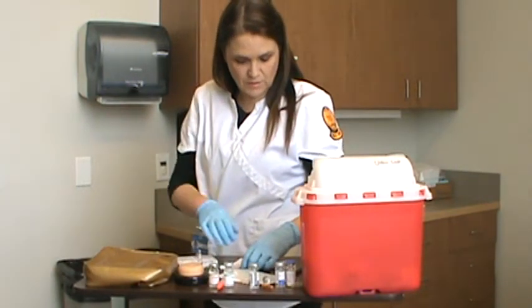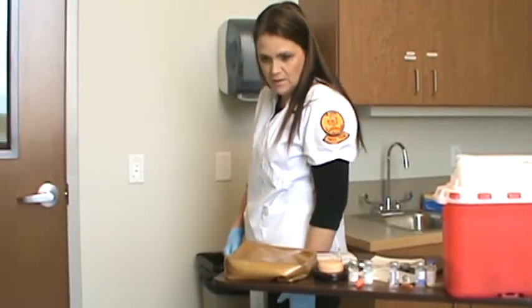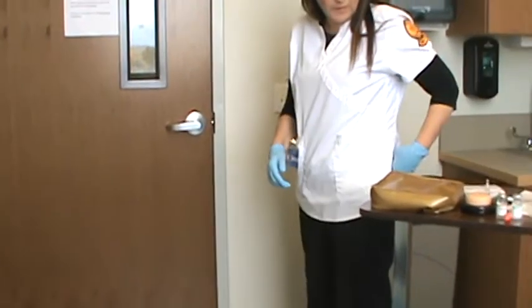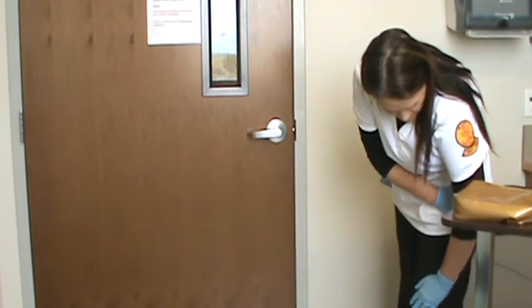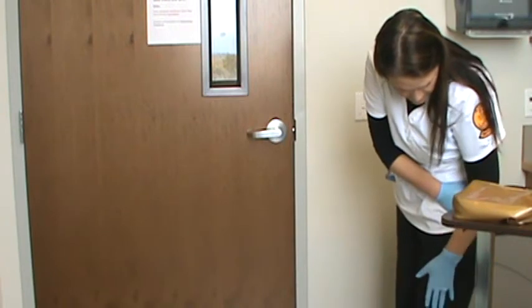The next one that you could give is the vastus lateralis, and this is a 3. Can you see that? This is 3 milliliters too. This one is a hand breadth from your hip to your knee, and right in here, but on the side, not on the top, on the lateral side right there.